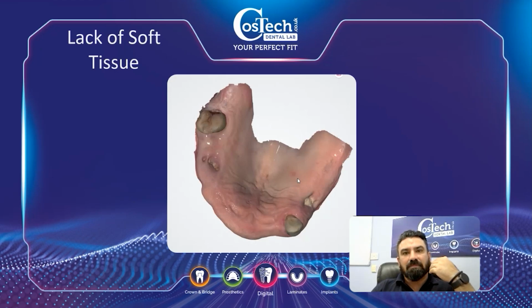This is where you trial it out with your patients and work out what's best. Some of the ones with bigger heads actually have a better depth of field, so you don't need to get as far down. The best thing to do is try it out on a few patients. When you get to know how your system works and what cases do and don't work for it, if you've got a very petite patient, it might be that they won't tolerate their soft tissue being moved that much to get the depth.